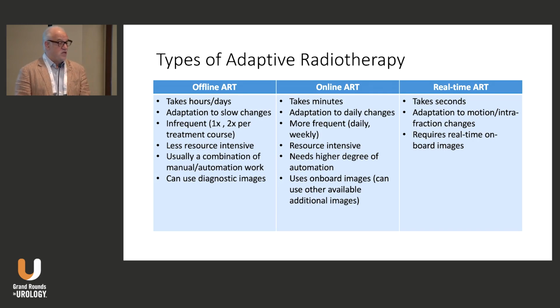And then we put the patient on the machine, and traditionally, in the past, we used X-ray imaging to determine whether we were in the right position, or now we use cone beam CAT scans, which are built-in CAT scan units on the machine. This is the traditional way of doing it, to see if our target is matching up to our planned target. And we have a plan, and that's what we do. Sometimes we're doing that live for SBRT. We're actually looking at a cone beam scan, seeing if the prostate has moved and if the normal tissues are in the same position. Or sometimes we're taking scans for more conventional fractionation, and maybe the therapists are checking it, and we're checking it at the end of the day. So that's standard treatment that we do.